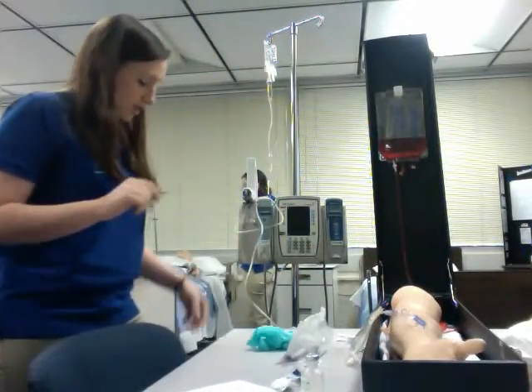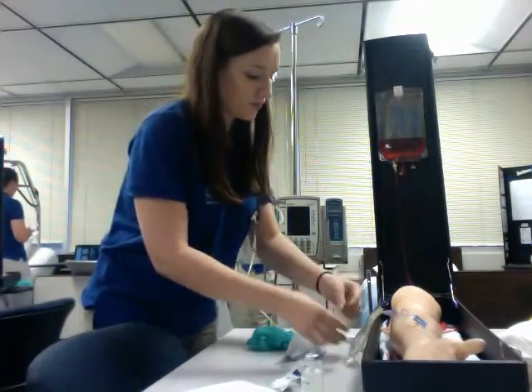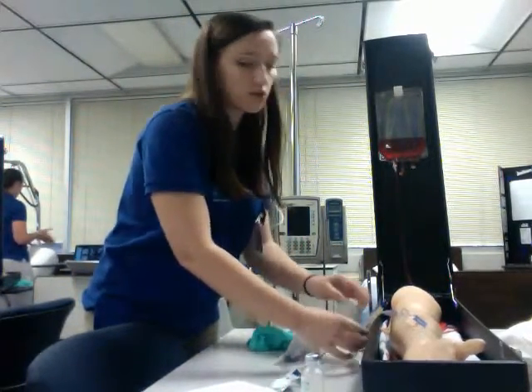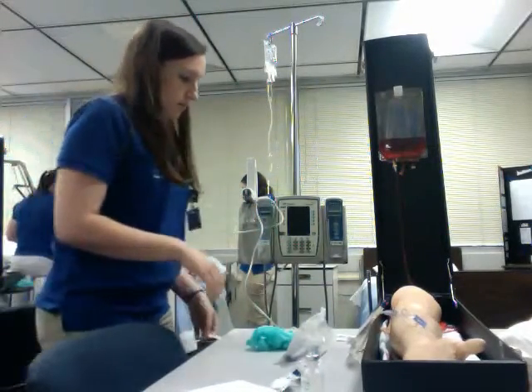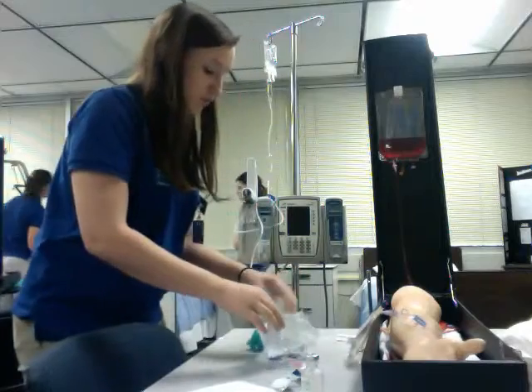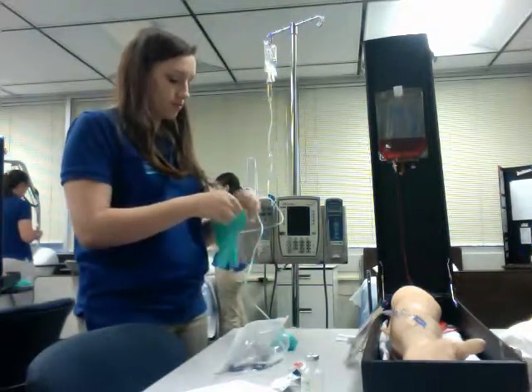So I'm going to go ahead and write up my medication label, which has the patient's name, the dose, route, and frequency. So that is all set. Now I'm going to prime my tubing. So I'm going to perform hand hygiene. I'm going to get my gloves on.